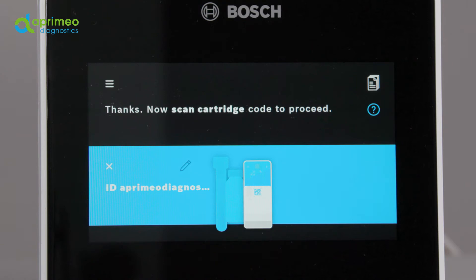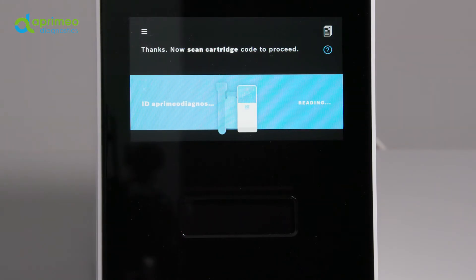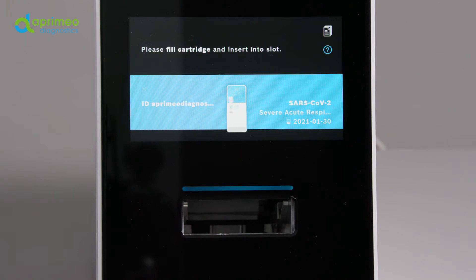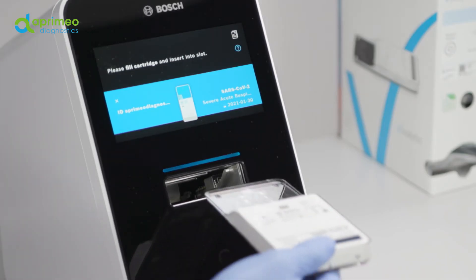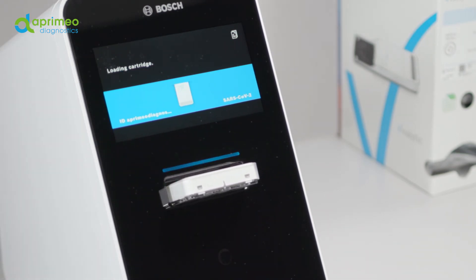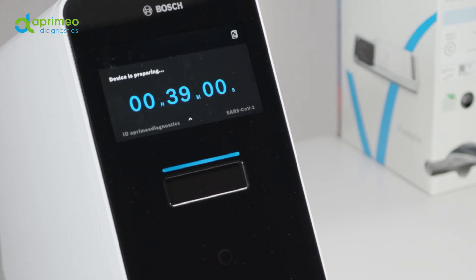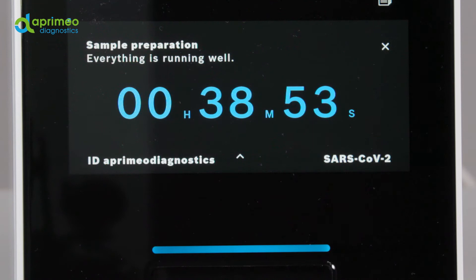Next, please scan the cartridge code. Hold the cartridge's data matrix code underneath the scanner. Again, white light and a red dot show that scanning is in progress. On the display, the test description and additional information are shown, allowing you to check once again that you're really using the right test. The analyzer slot opens up. Please insert the cartridge in the direction marked by an arrow into the analyzer slot until you feel a slight resistance and the cartridge is pulled in by the device. The slot closes automatically and the test is launched.